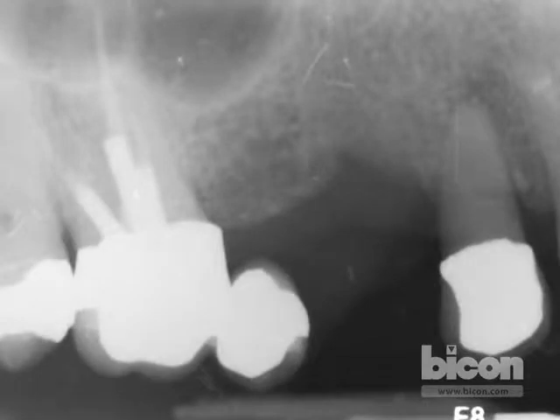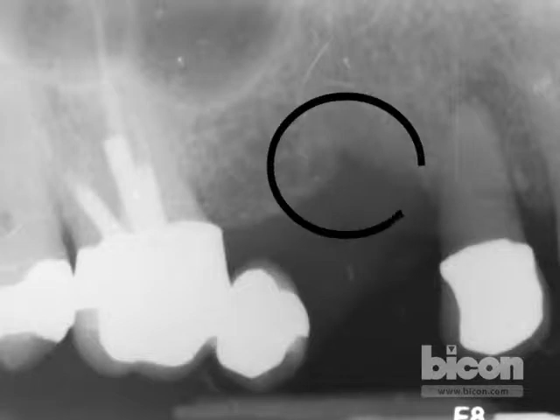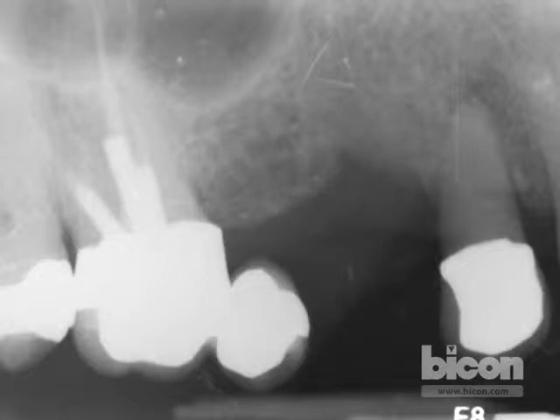As you see on the radiograph, right in the center of the screen is a slight defect that will not be of any clinical significance, as we will have the implant placed within the crest itself, and for that we will be able to avoid having to graft the crest. However, the buccal plate, as you will see shortly, is deficient.